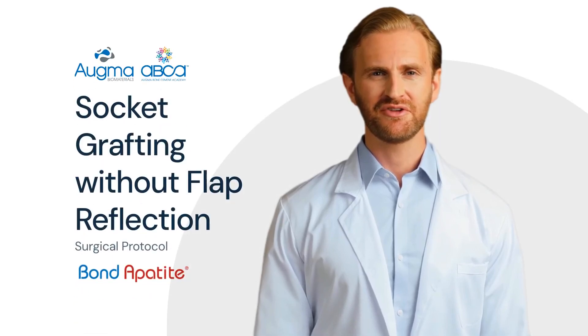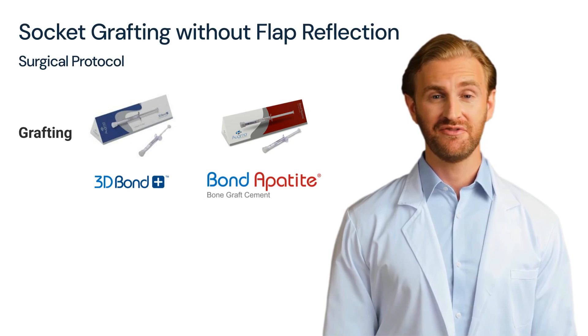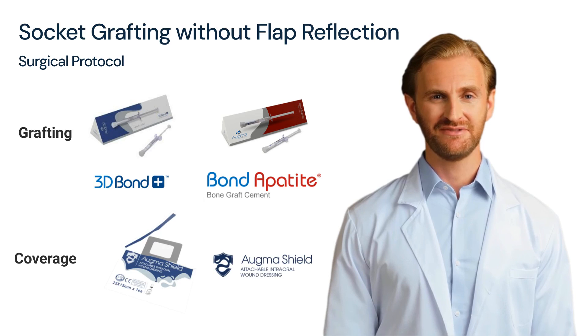This video demonstrates the protocol for socket grafting without flap reflection using AugmaBond Appetite bone graft cement. For this protocol you can use 3D Bond Plus, 0.5 cc syringe, or Bond Appetite 1 cc as the bone graft, and AugmaShield for coverage. Watch the following steps from site preparation to closure.